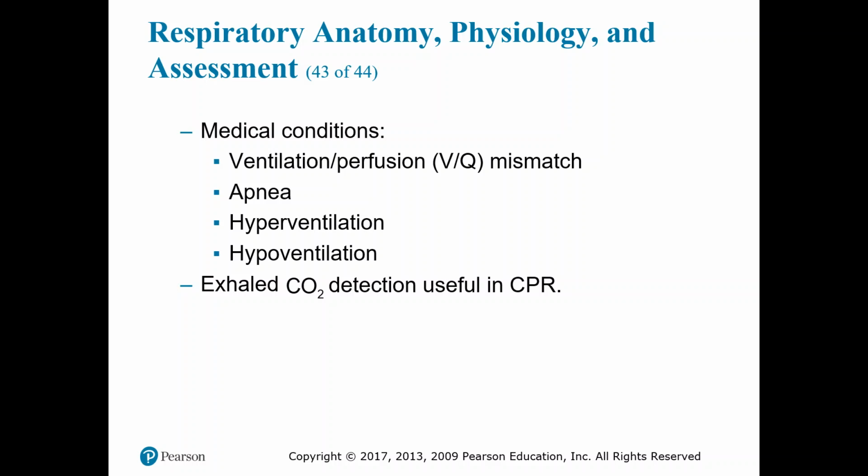Misplaced ET tubes represent a significant area of liability in EMS, and the documentation provided by this technology can provide irrefutable evidence of proper endotracheal tube placement and recognition of displacement, either way. It is becoming the standard, and I feel like it's not being widely used enough, but that's a personal thing. I think we should use it on anybody with respiratory distress to give a good indicator of what's happening, and it may narrow down our differential diagnosis and guide our treatment better.